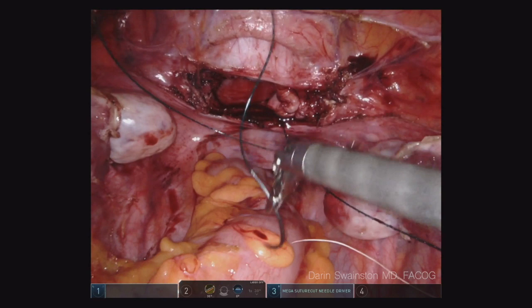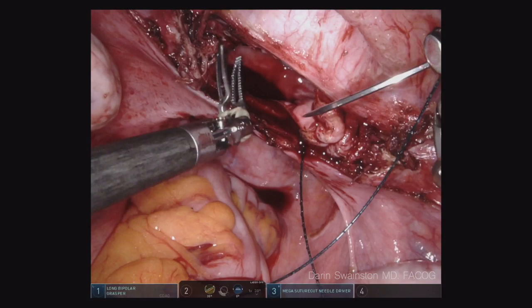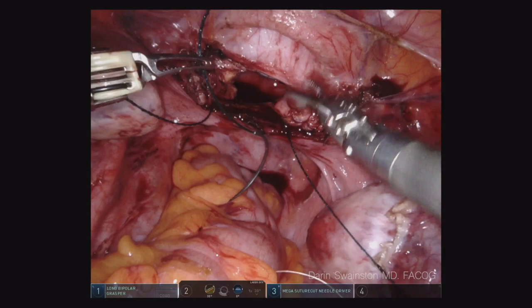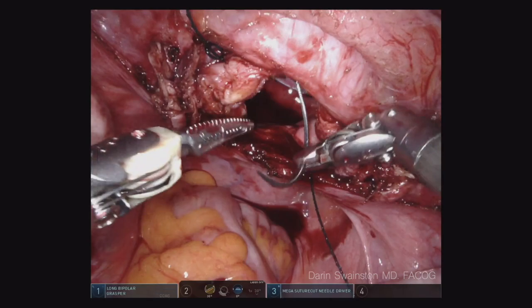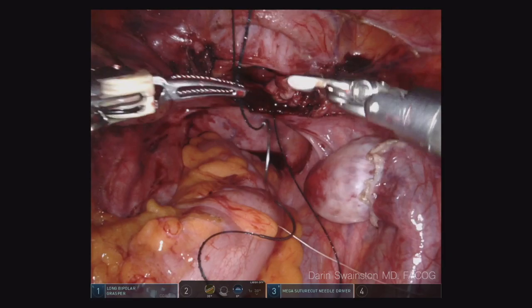I'm going to show a long bipolar grasper now, which is probably a preferred instrument to use when closing the cuff. It's got a long tapered tip with some serrations on the end and you can really pull hard and get the perfect angle you're looking for. Notice how wide and deep I get that first bite. The second bite I want to go a little more superficial because I want the edges of that vaginal mucosa to literally evert and be kissing. You'll see that as I tighten that down — see how they're touching each other? They almost look like lips. Now we can finish closing just the vaginal mucosa.